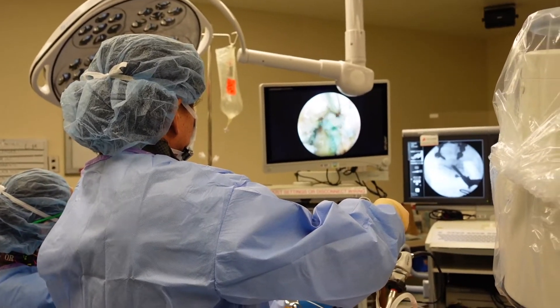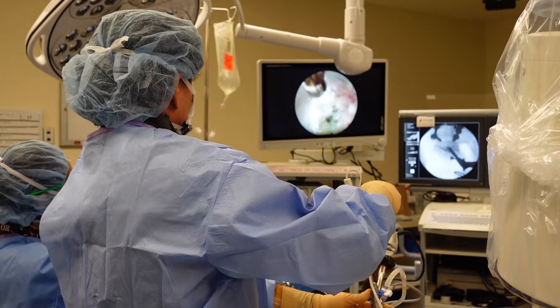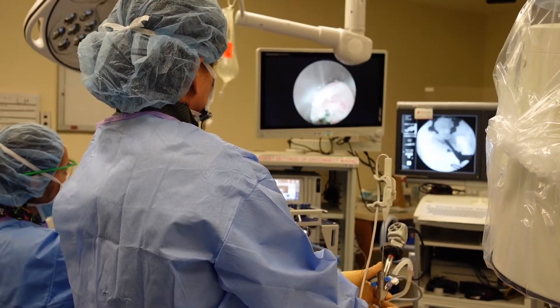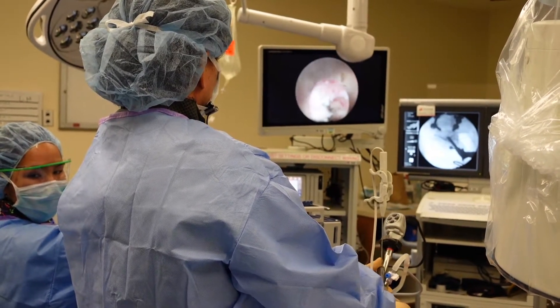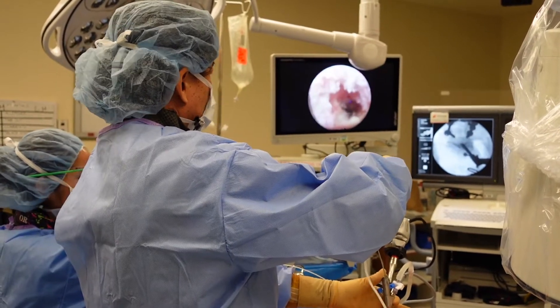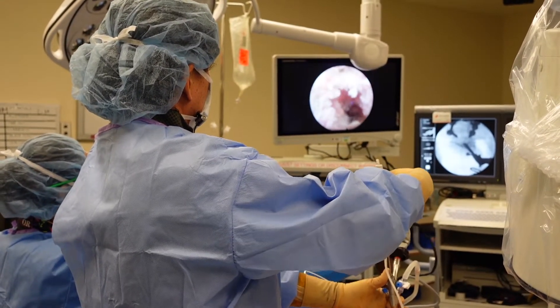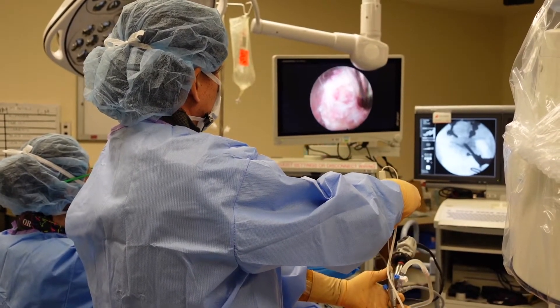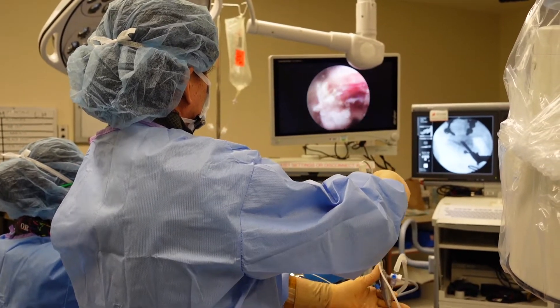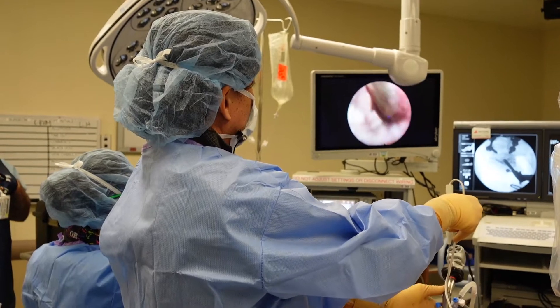That looks good. There's the facet joint line — that's so cool. And there's the medial edge of the facet joint. Everything's upside down and backwards right now.